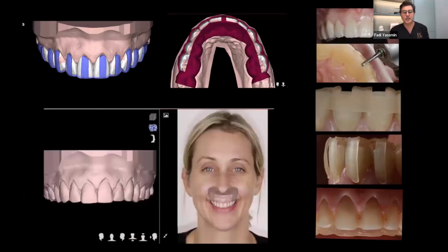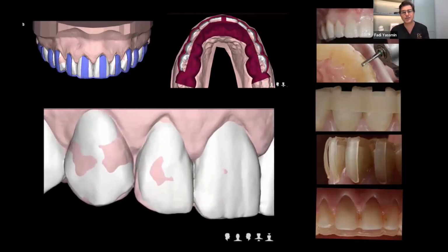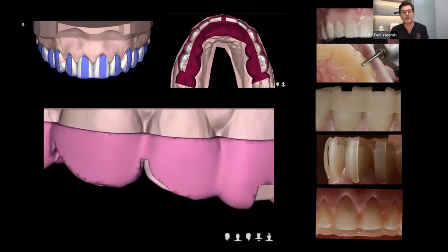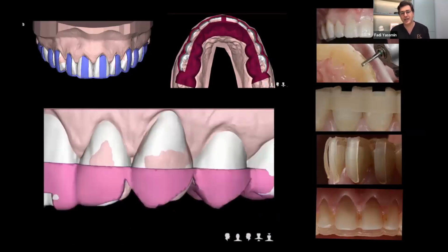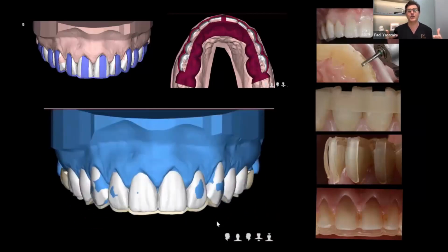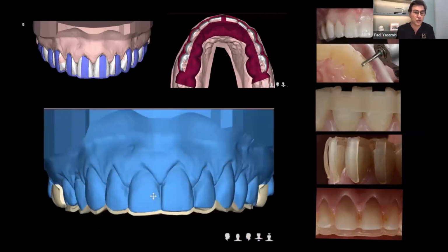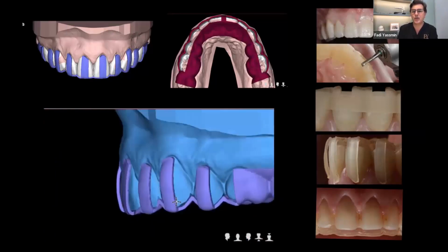The final veneer design is confirmed, exactly down to the millimeter of where those teeth are going to be, so that when we design our guides, it's based on where the veneer will be. So if you have enough reduction in that area when the guides are put on, then there's no need to reduce, or you reduce less. We've got the incisal guides, you can see also there.